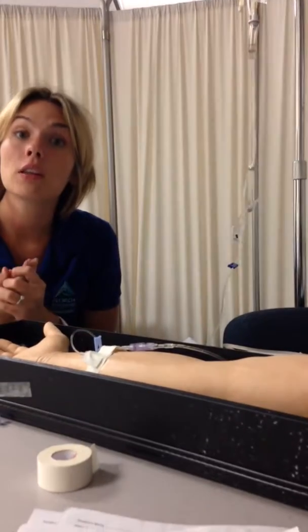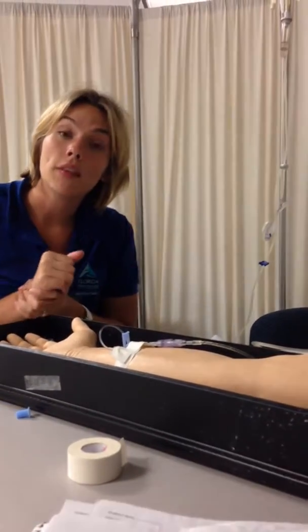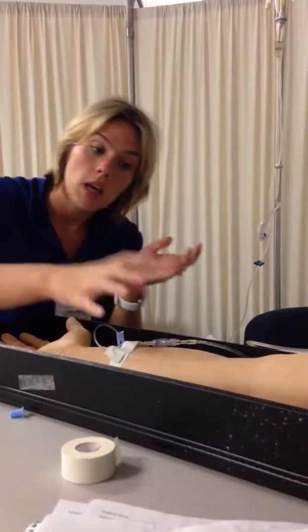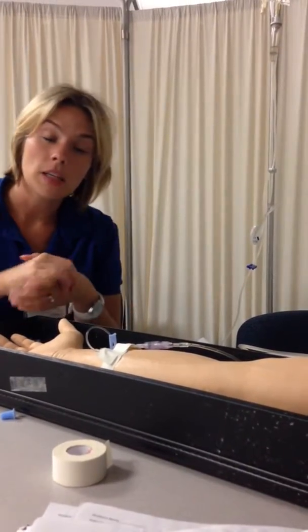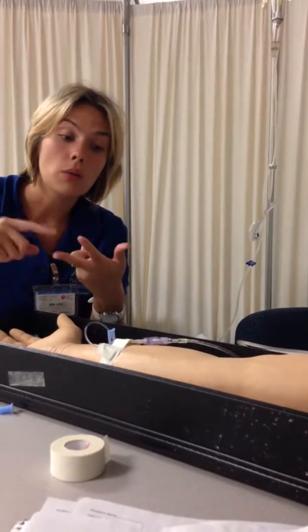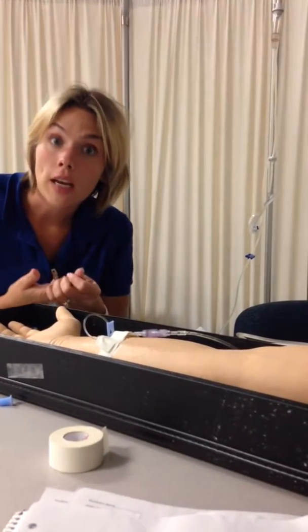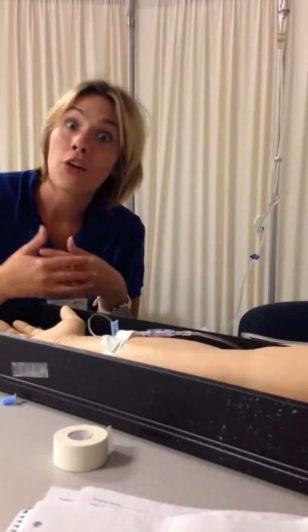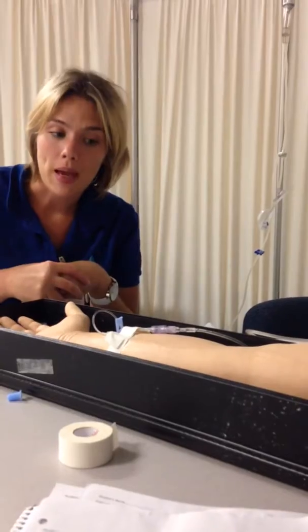I let my patient know that it's going to go over an hour. I'll come back in 10 to 15 minutes to check on them. Once I leave the room, I come back in 10 to 15 minutes. Everything looks good. The patient has no complaints. There's no mottling to the skin. The vein has not blown. They're tolerating it well. They don't have any side effects. I tell them I'll be back in another 45 minutes.